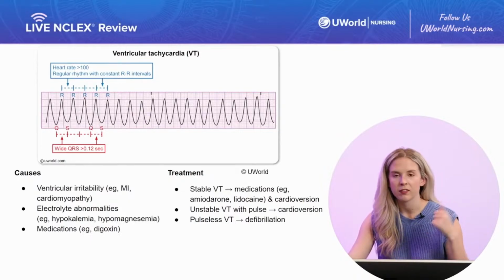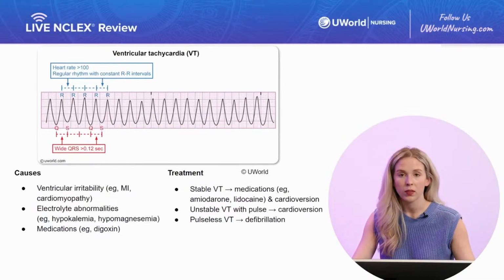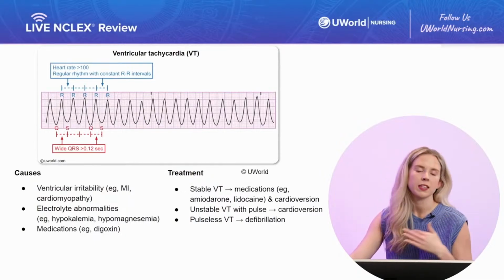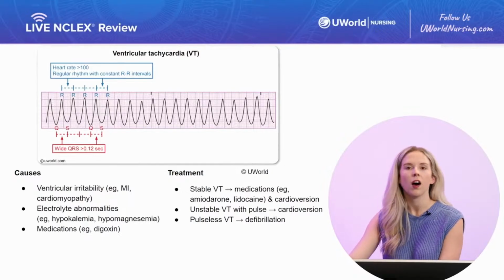Again, it's tough because we have stable VTAC, unstable VTAC with a pulse, and then pulseless VTAC. So you have to do a slightly different thing for each one of these steps, but you all did so well. So with that being said, let's move on to VFib.